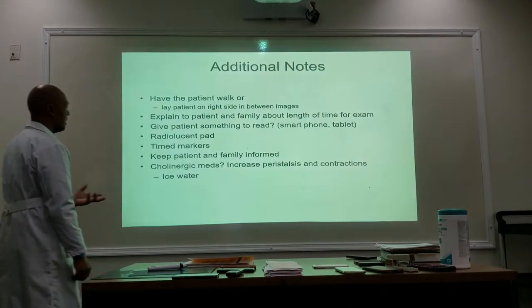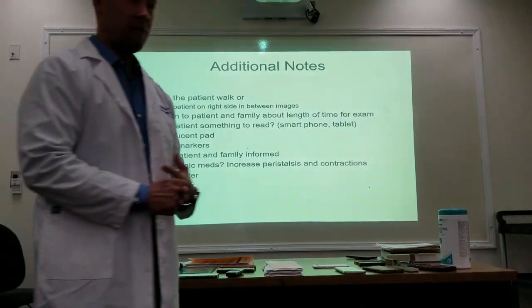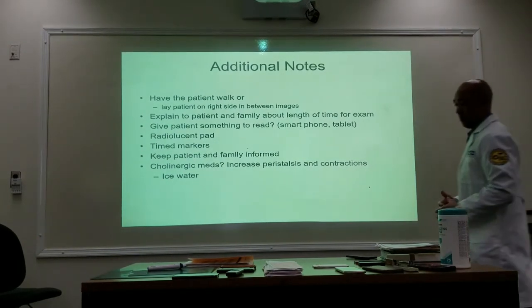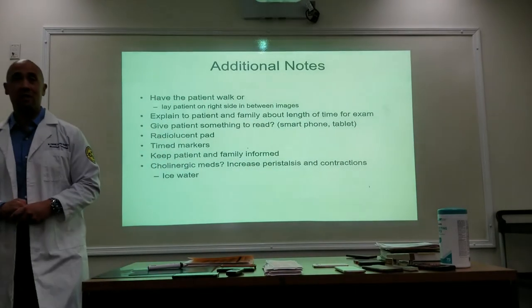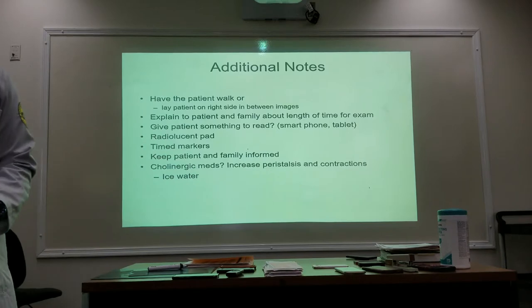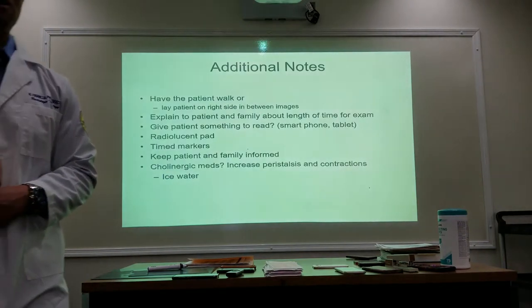Now here's cholinergic meds. This is interesting. If the contrast isn't moving around very well, there's a couple of tricks that the doctors and the technologists do. One of the things that we do is we purposely talk food with them. They're NPO, they haven't eaten, they're starving. So when you start talking food with them, you hear this, because now they want to get something to eat.